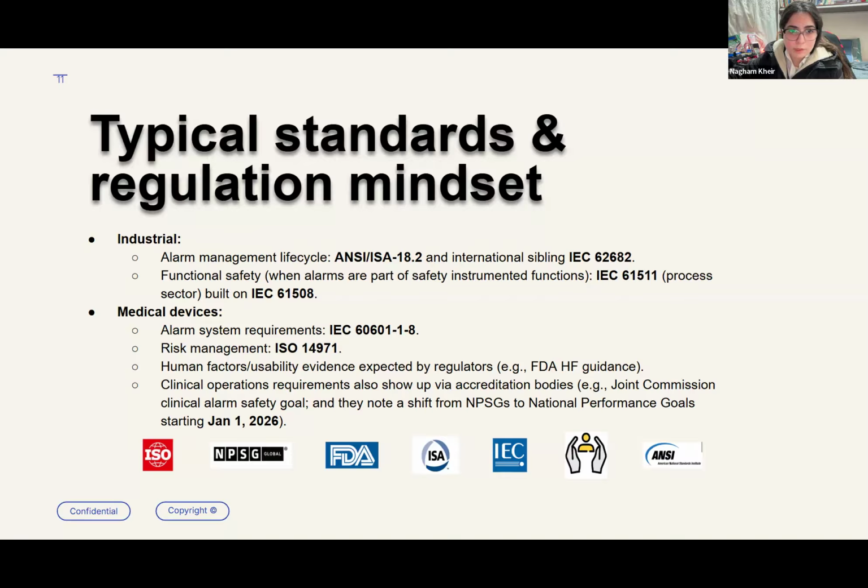Did I mention the risk estimation and the hazard identification? I don't think I did. So in the ISO 14971, we have hazard identification, risk estimation and evaluation, risk control, and production and post-production monitoring. Okay, now I've said that.